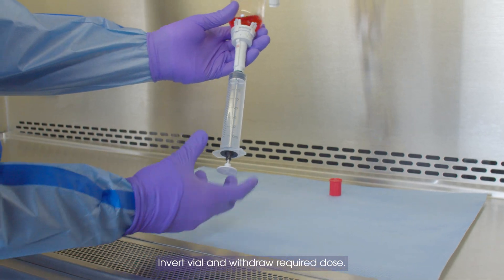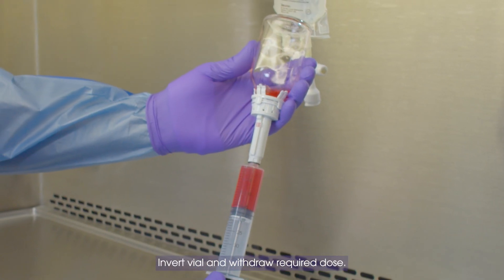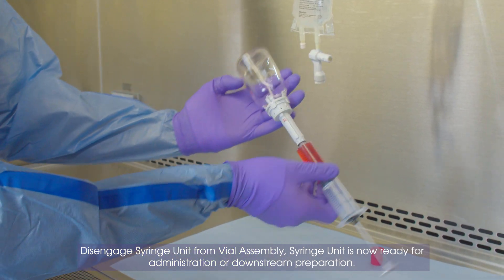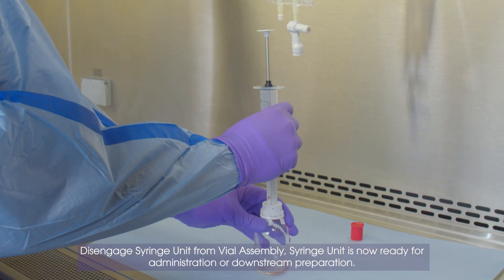Invert vial and withdraw required dose. Disengage syringe unit from vial assembly.